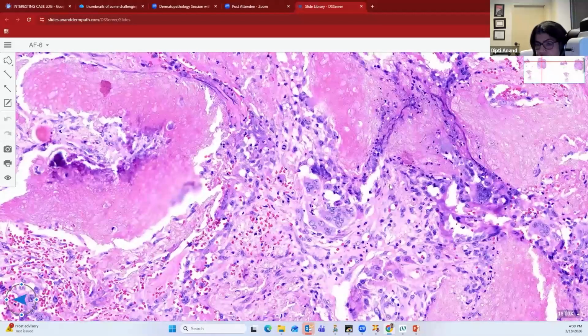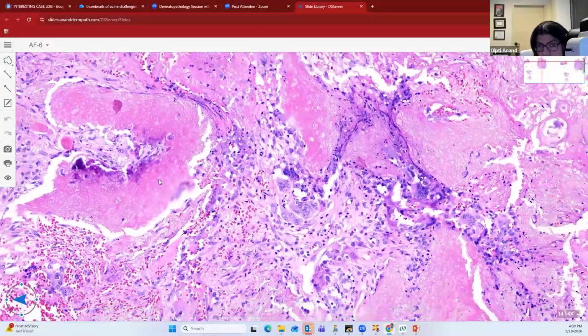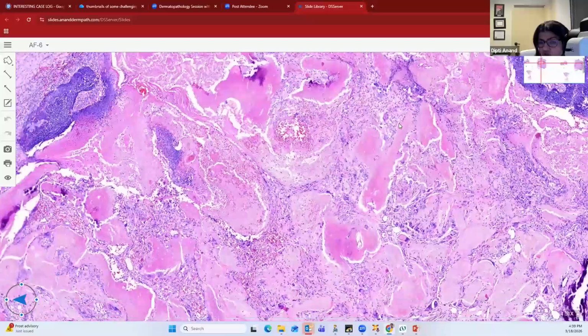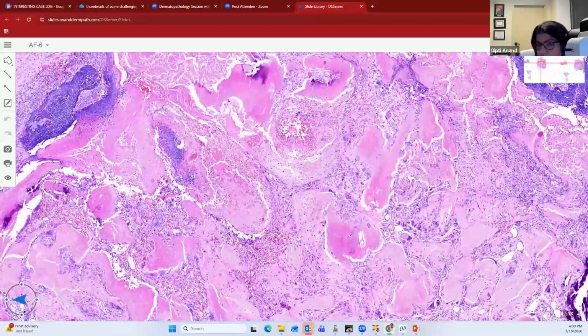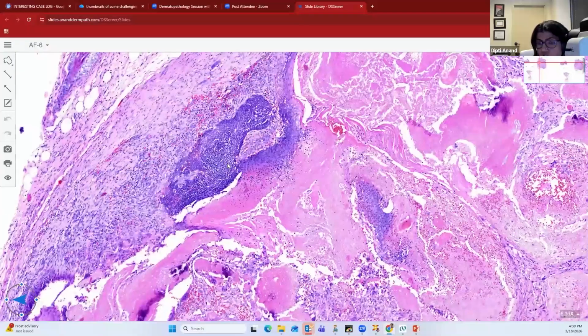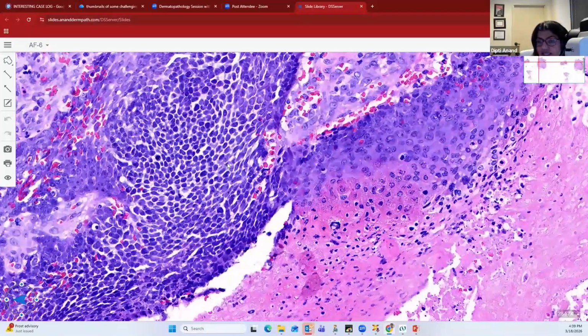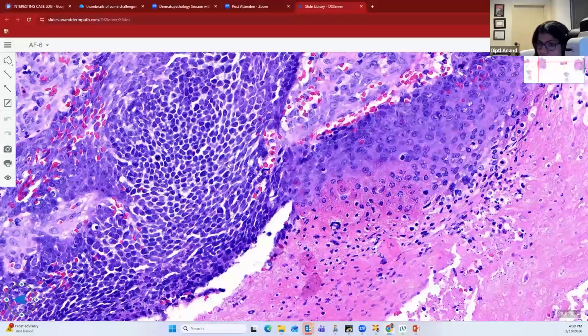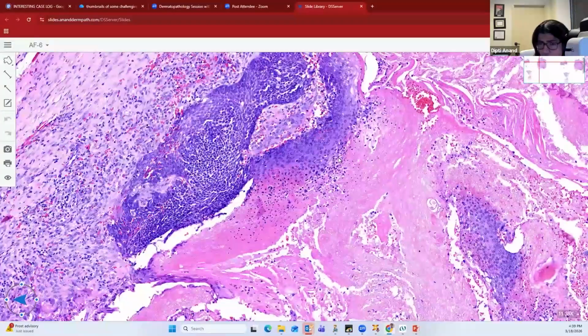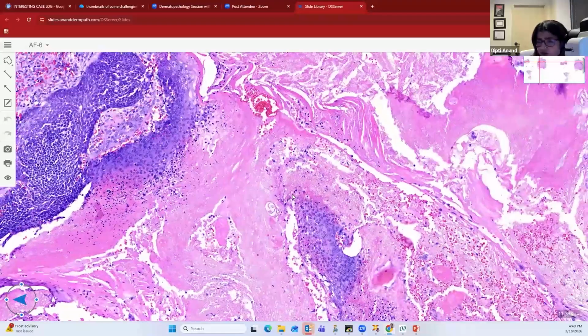There is often an associated granulomatous inflammation with giant cell reaction to the ruptured keratin. And often there is secondary dystrophic calcification, and hence it is also called calcifying epithelioma of Malherbe. A pilomatricoma which shows a predominant basaloid component, they will definitely try to confuse you with, again, a pilomatrical carcinoma. So remember, that is going to be the wrong answer. We do not want to pick that up. So this is a nice example of a pilomatricoma.